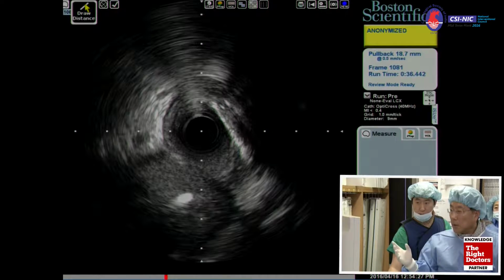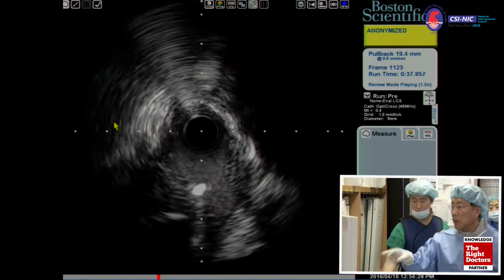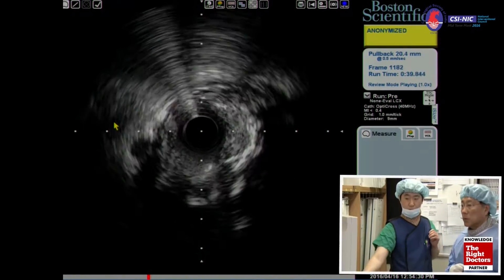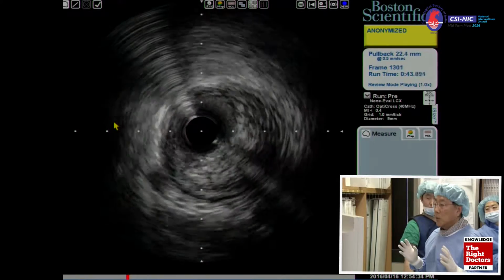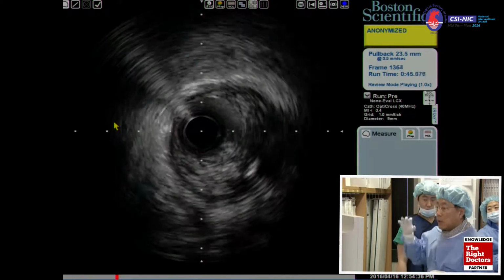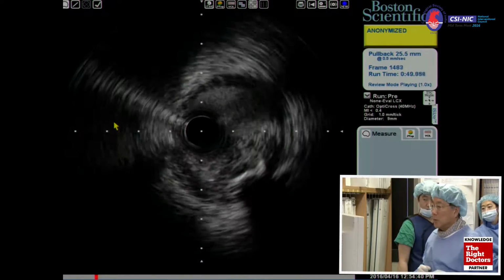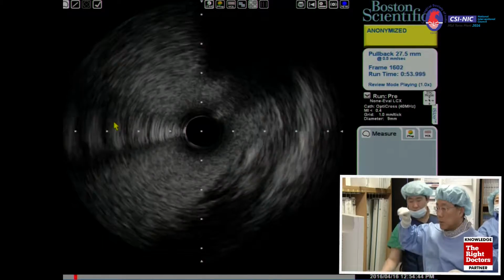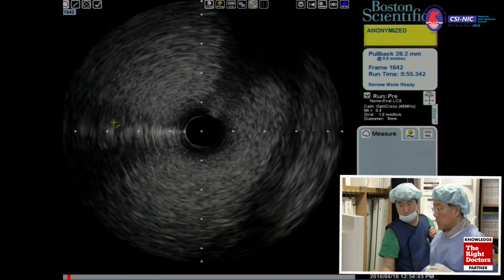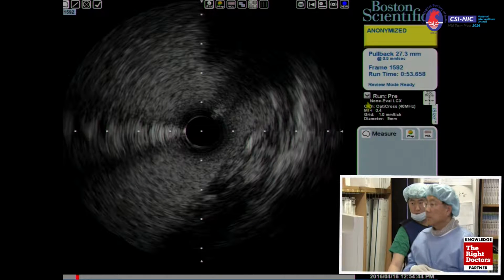Okay, go ahead. So that is LAD coming in from the 6 o'clock. This is the main disease. Size-wise, almost 4.0. Lots of plaque, it's mottling density. They are clearly related with some ruptured plaque over there. Ostial part is eccentric plaque with superficial calcium. Right. Would you show us again the LAD run from the main?